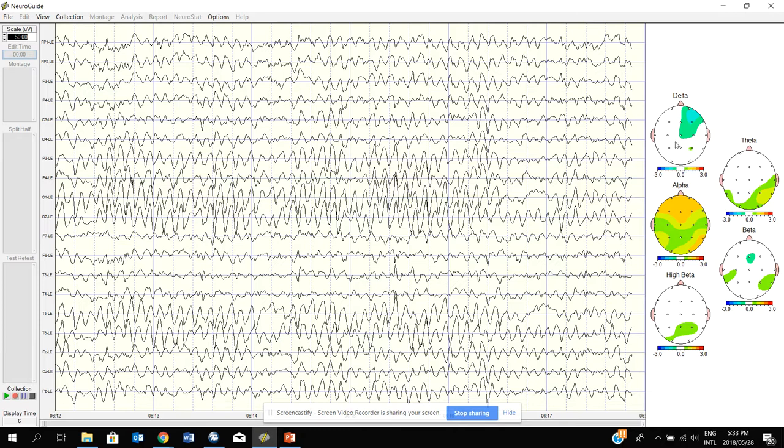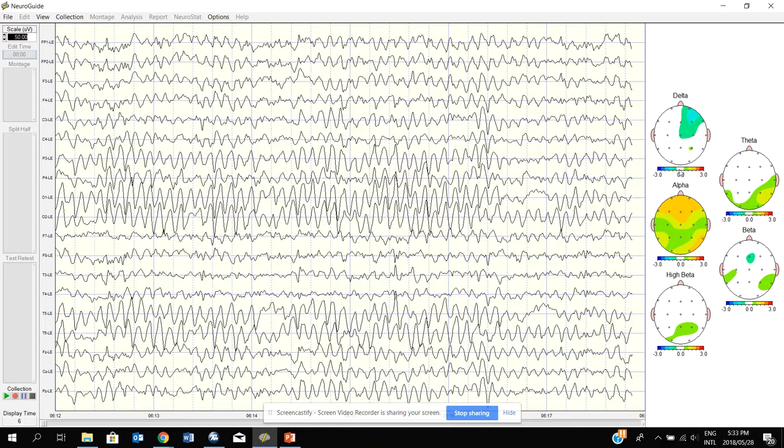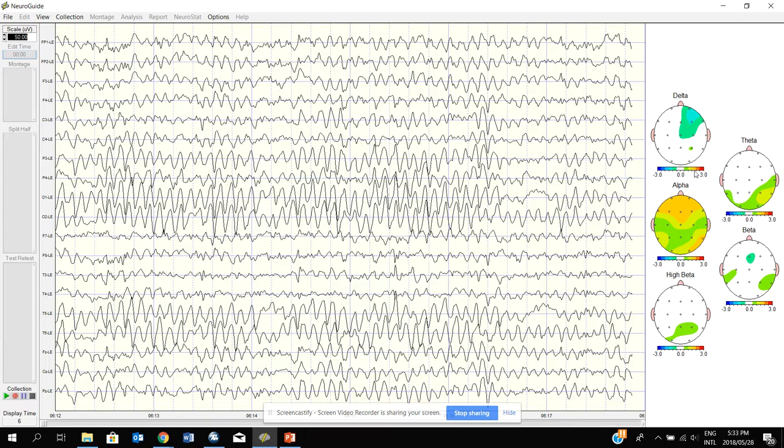For each head, we try to determine the electrical activity, how much does it deviate from normal. If we say zero is normal, then close to zero, one standard deviation from zero above and below is normal, and it's represented by just plain white color on the head. But as we move to this side, the colors are becoming brighter. We are moving beyond one standard deviation, two standard deviations, three standard deviations from zero. So we put an excess of activity here. There's excess EEG power.